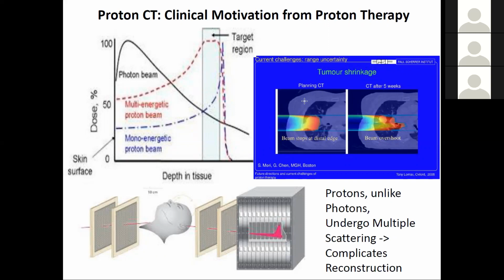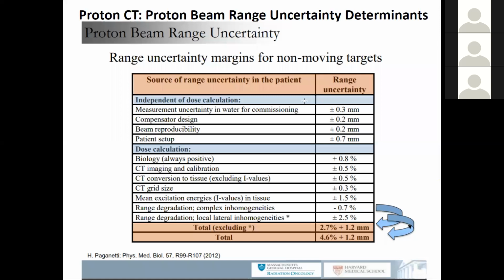where you're actually delivering your protons. Particularly if the CT changes, you'd like to have a way to see where you're actually delivering your protons, because it can be moved around by things like the patient's anatomy changing. Other things can be sources of uncertainty. There are lots of them.